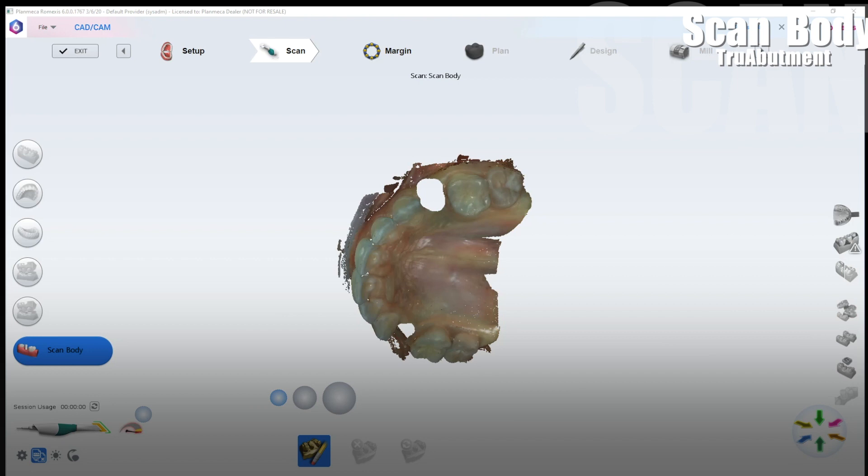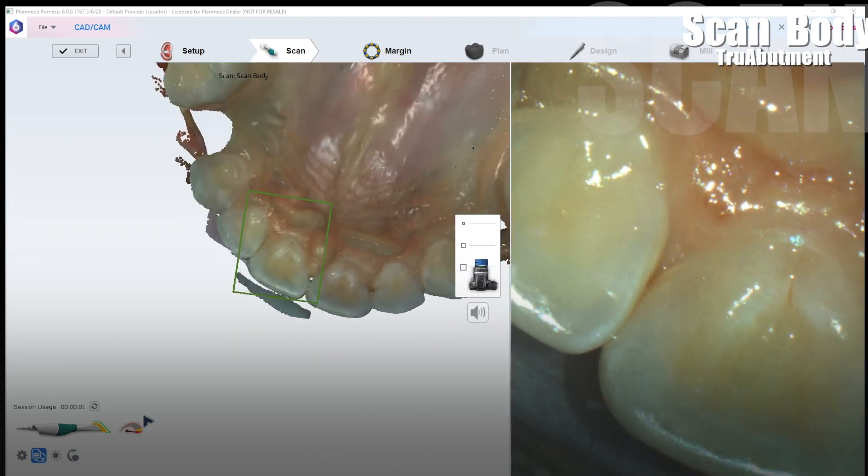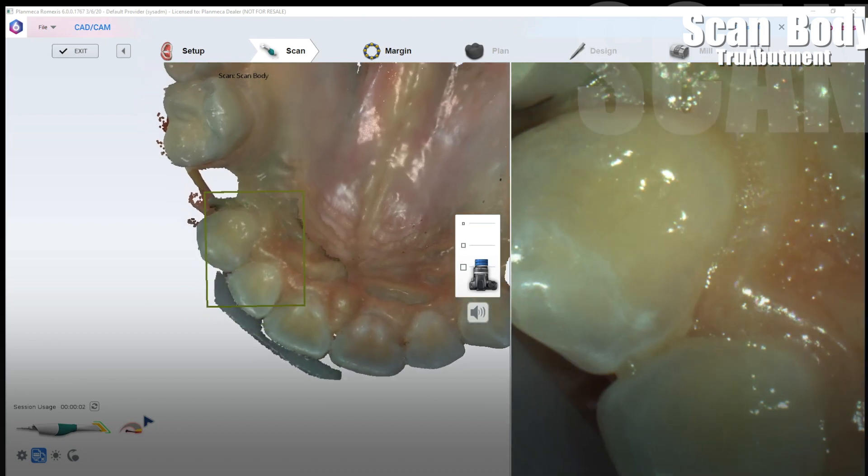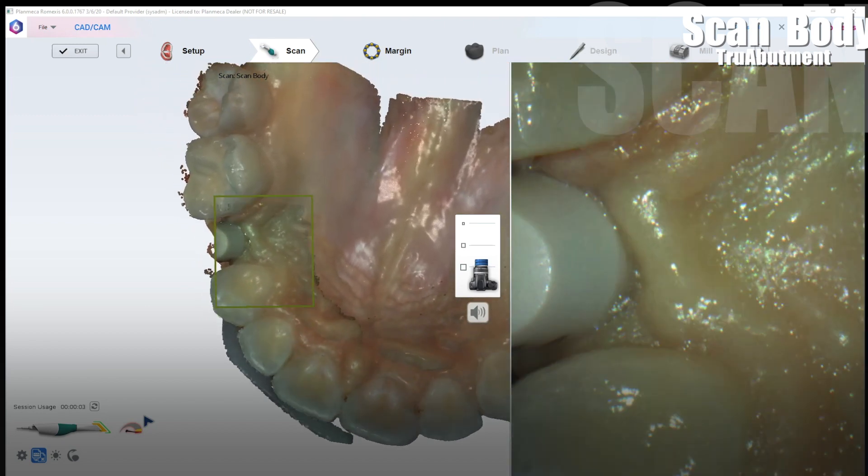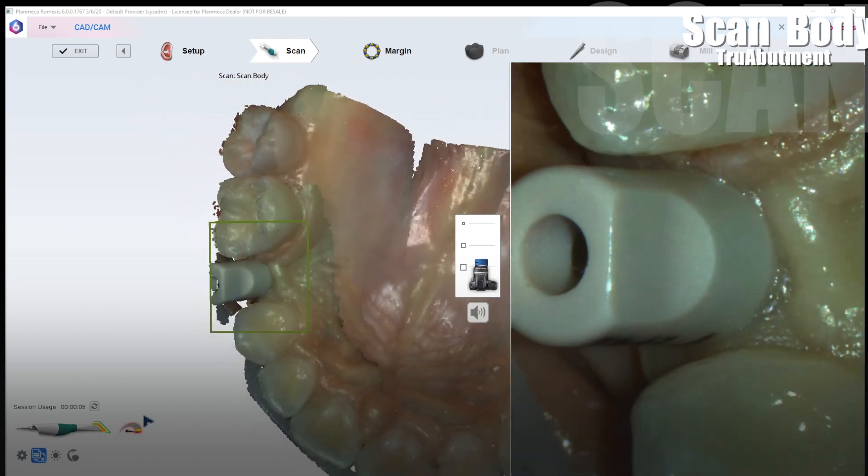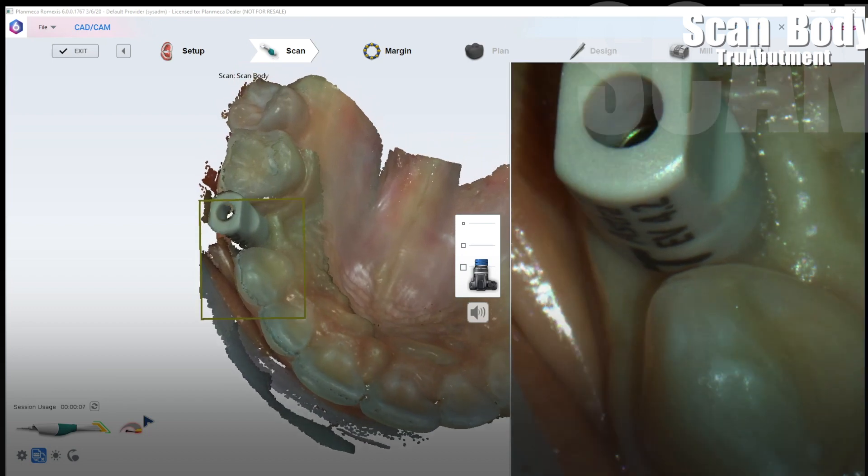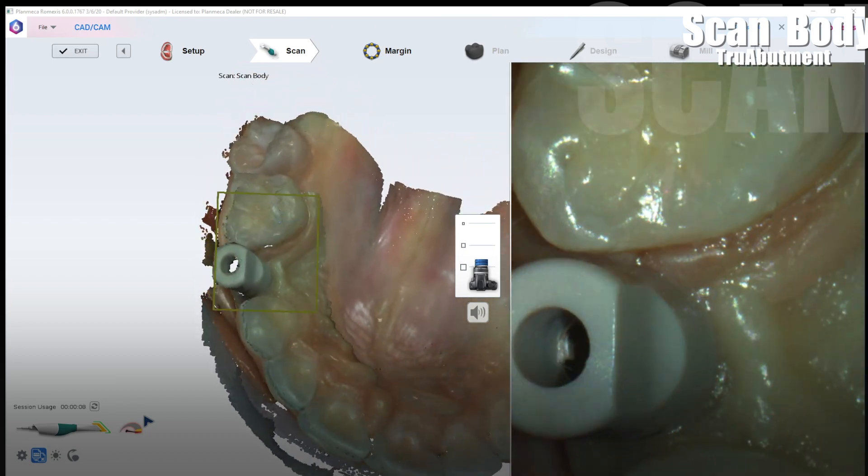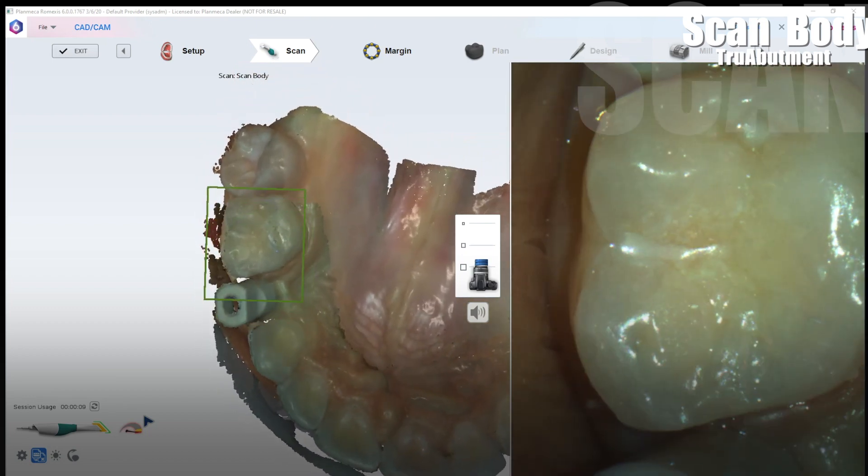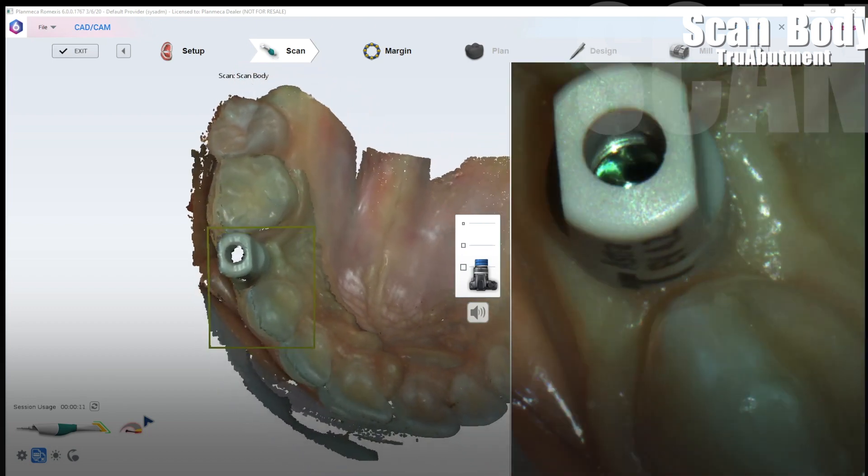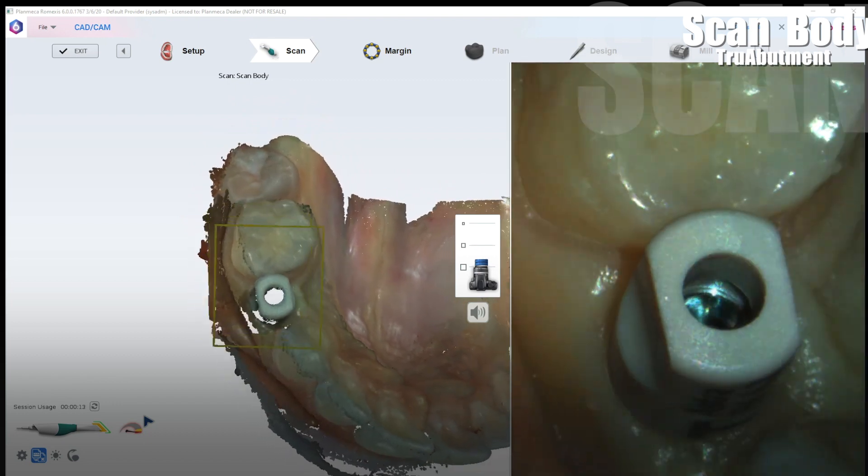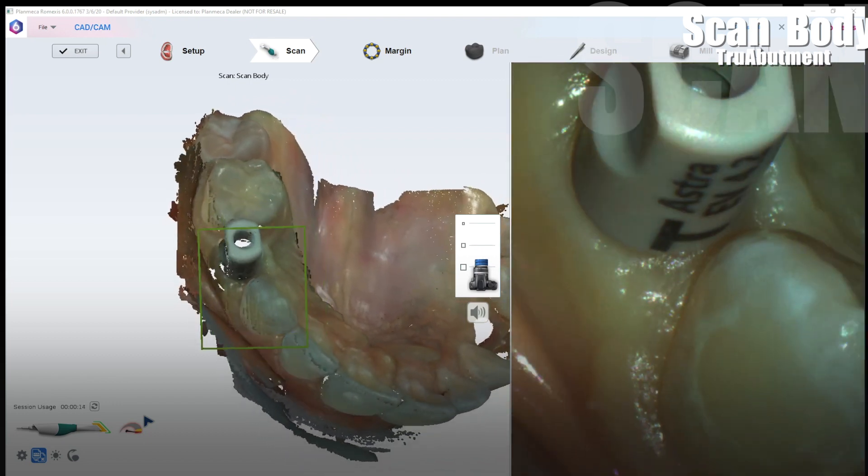And then this is the easiest part for sure. You're just going to go ahead and pick up the scanner. Screw in your scan bodies in this case use the appropriate scan body for that implant. I'm using a TruAbutment scan body here for this Astra implant. And I like to once again scan starting from the lingual or buccal but usually at the soft tissue base where the scan body meets the tissue, not at the occlusal.